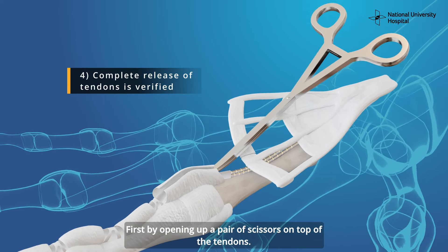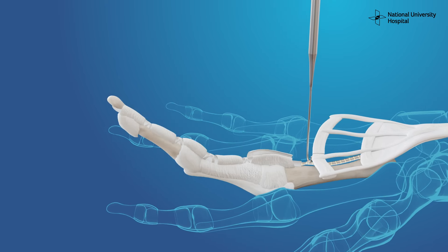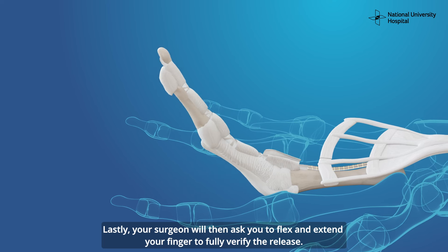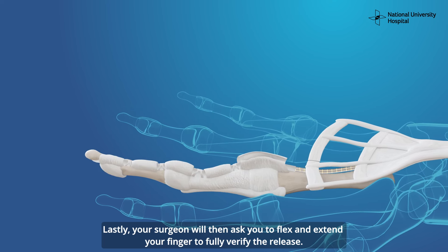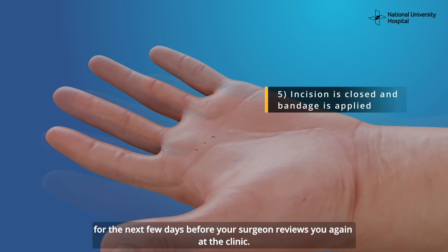The complete release of your tendons will be verified in three ways. First, by opening up a pair of scissors on top of the tendons. Second, by pulling on the tendons with a tendon hook. Lastly, your surgeon will then ask you to flex and extend your finger to fully verify the release.